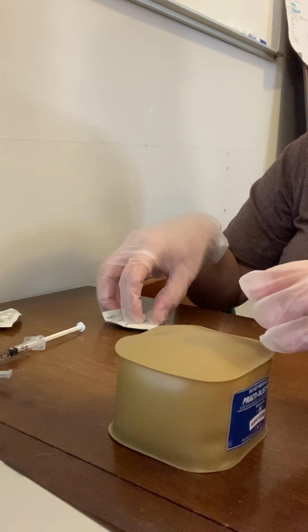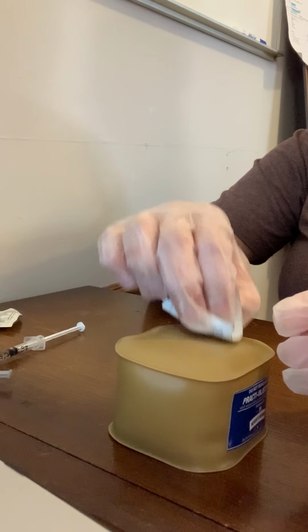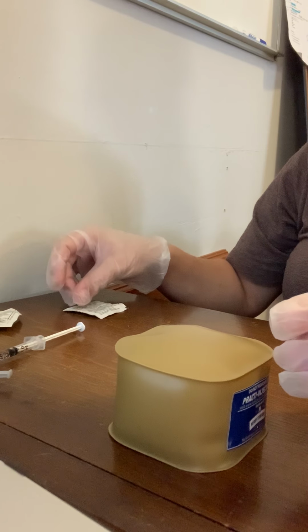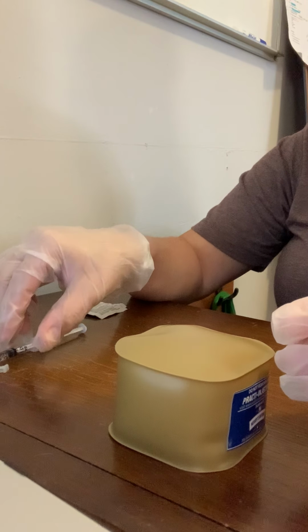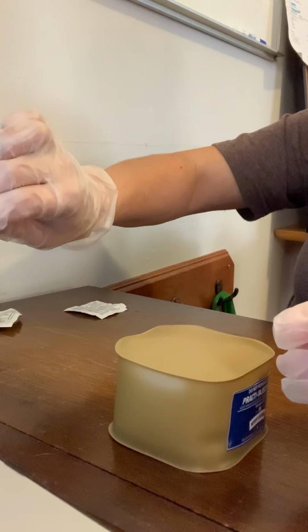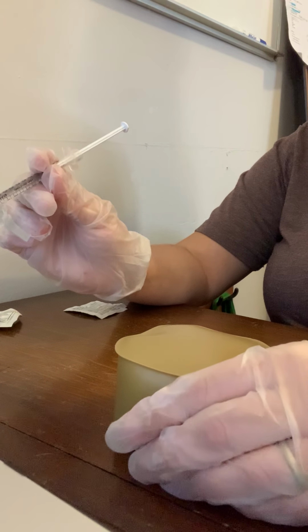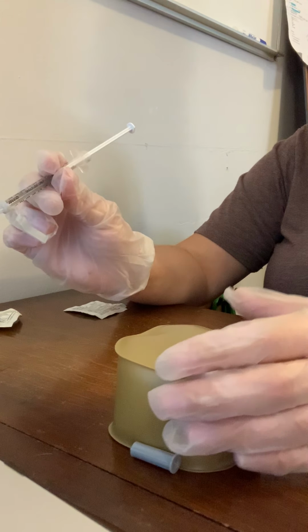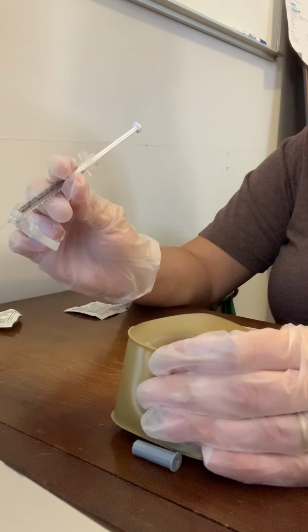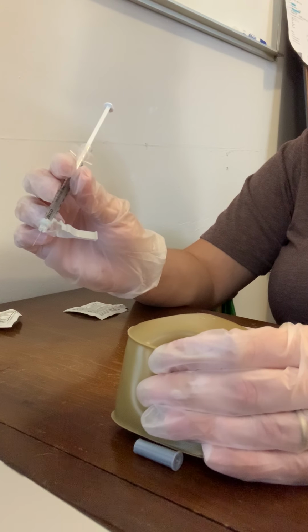I'm going to cleanse my site from the inside out and let it air dry. I will remove the cap from my needle. I'm going to pinch my skin. I'm injecting at a 90-degree angle because my patient is 250 pounds.